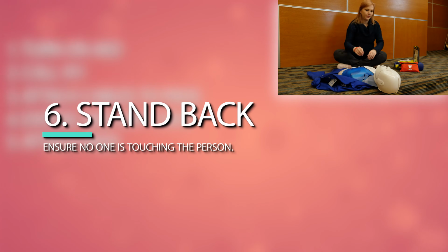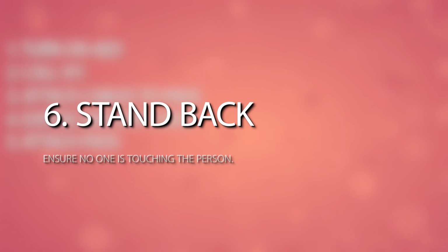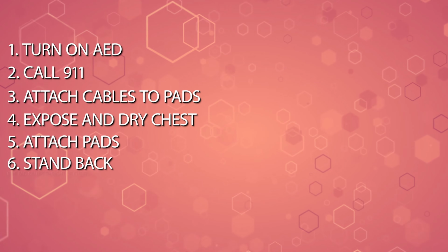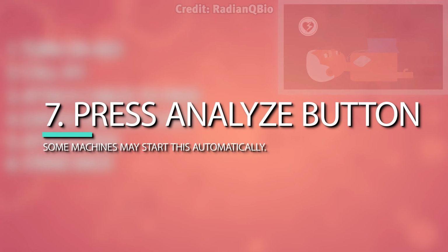Step number 6. Stand back and make sure that no one is touching the person receiving the shock. Step number 7. Press the Analyze button on the AED and follow the voice prompts. Some machines may automatically begin analyzing once the pads are placed.